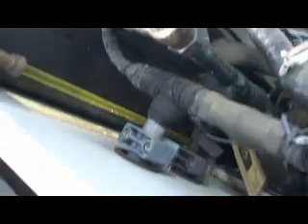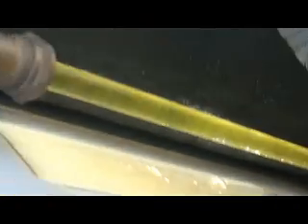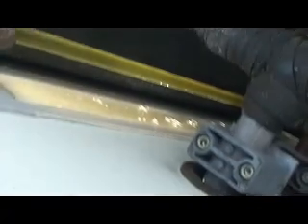You can see the area of the square where you can take the top off the machine and clean it. You do have water valves on this. Here's your water pressure gauge. Now that we have the top off, you can see the water pressure gauge here. You have to usually take this front cover off here to read your pressure, unless you use a mirror. You can also take a rag and wipe this inside out while you have the top off also. So, hey Chris, you grab a rag. There's one right in the front of my truck, I think.